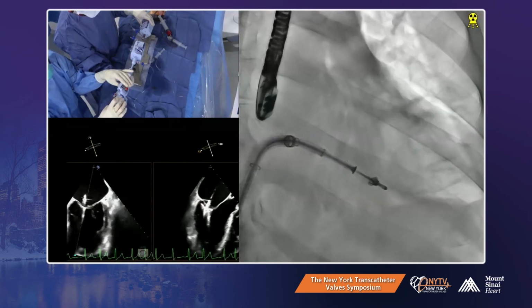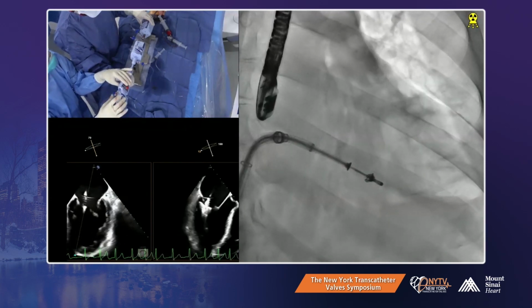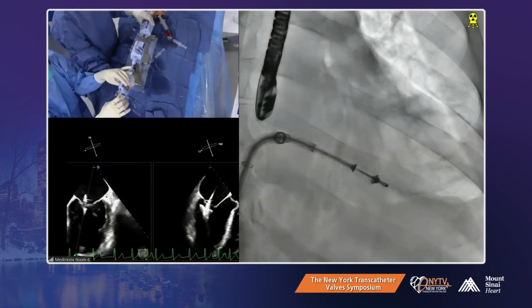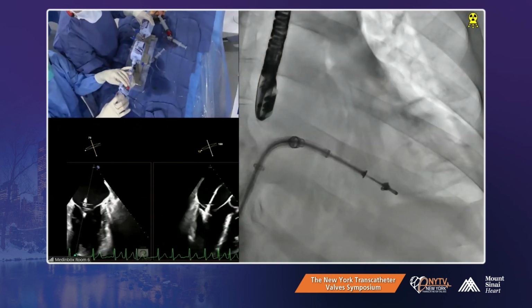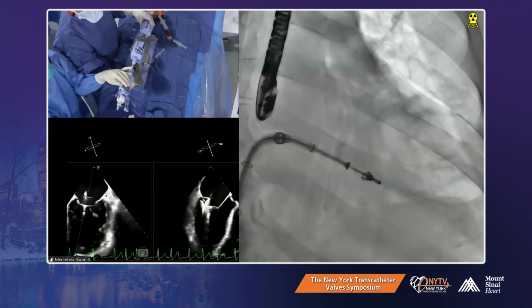Advance the clip. I'm going back in. Close it to 120. Can you close it? Closed. And then we'll go counterclockwise. Close a little bit.